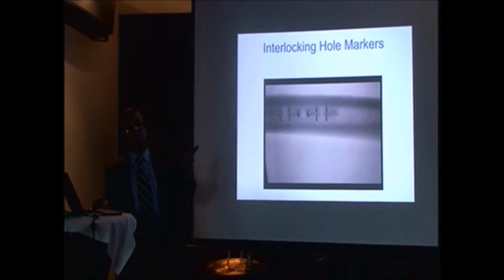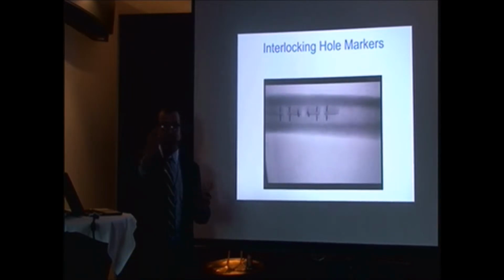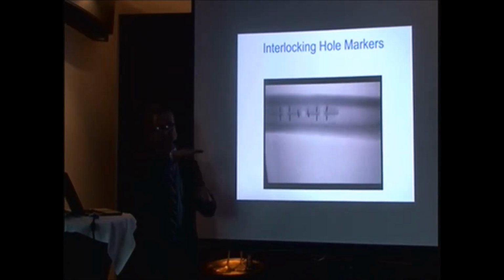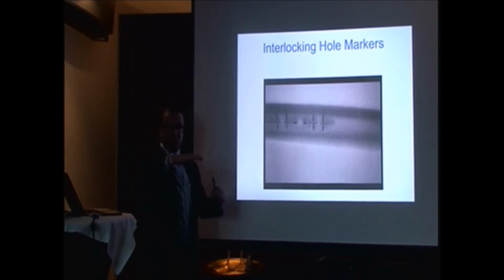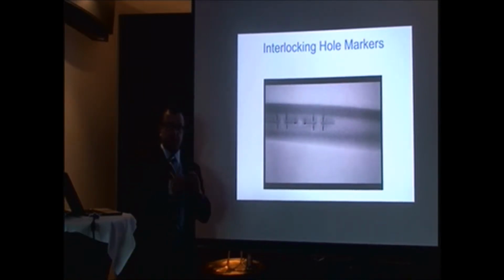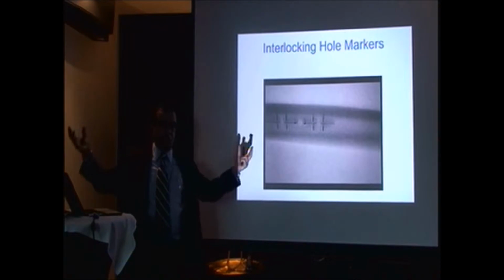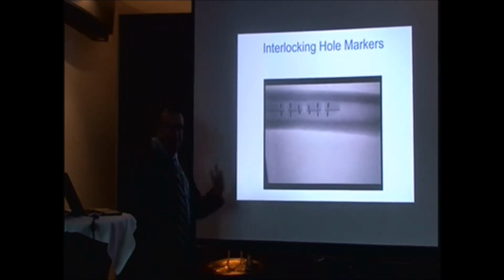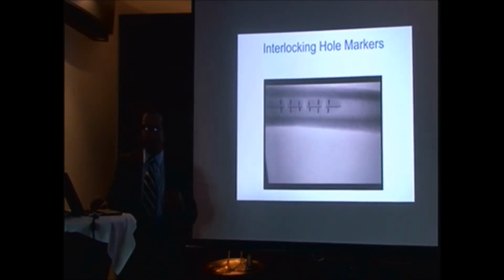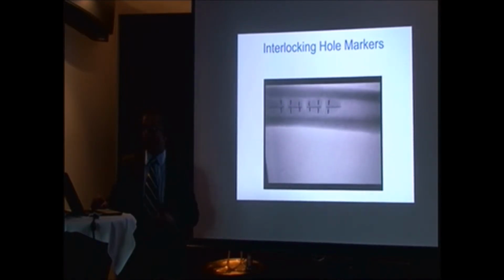If you want to use live fluoro, I don't like live fluoroscopy, it's too much radiation, but you can rotate the live fluoro and do it. If you have the handle of the insertion guide, that is perpendicular and parallel to the holes, you can use that as a first estimate. Within 1 or 2 motions of the image intensifier, I can get 2 dots. My partner likes to make the room radiate, so he puts his foot on the machine and it's live fluoro. But if you really want to be an efficient surgeon, the goal is to do all of your intramedullary nailing with less than 1 minute of total fluoroscopy time, if it's possible.